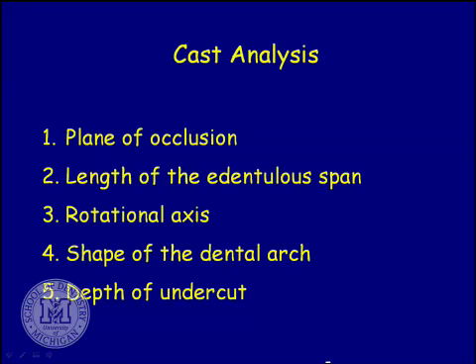So your overall plane of occlusion is really like a ski jump going up there. Not such a good thing. Maxillary plane of occlusion: some posterior teeth unopposed and extruded down quite a bit. So your maxillary plane of occlusion goes level across here and then dives way downhill. Not such a good thing.